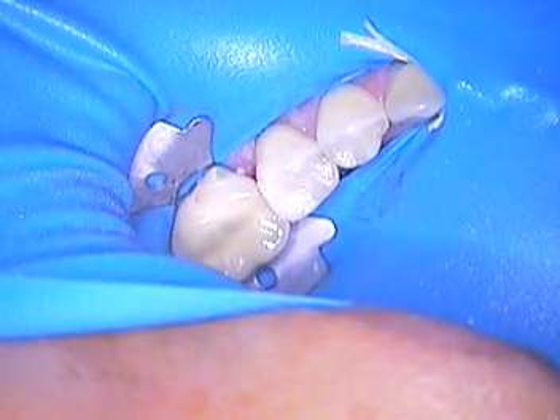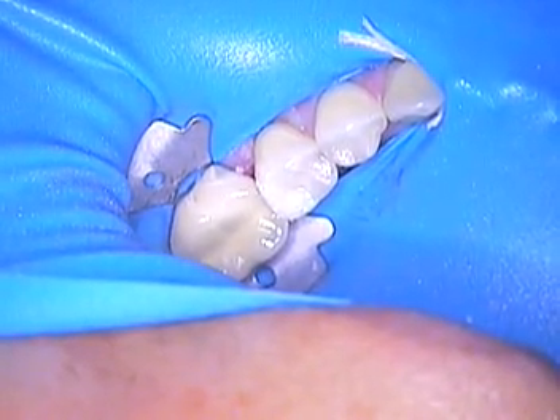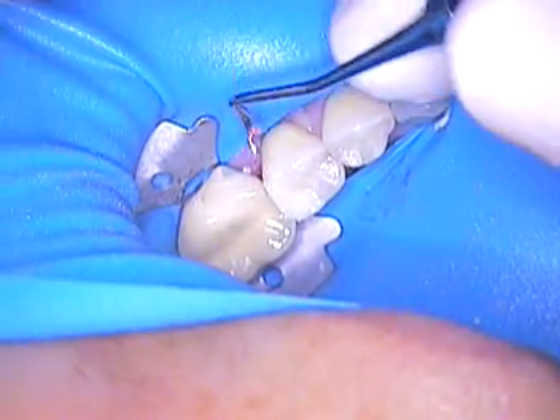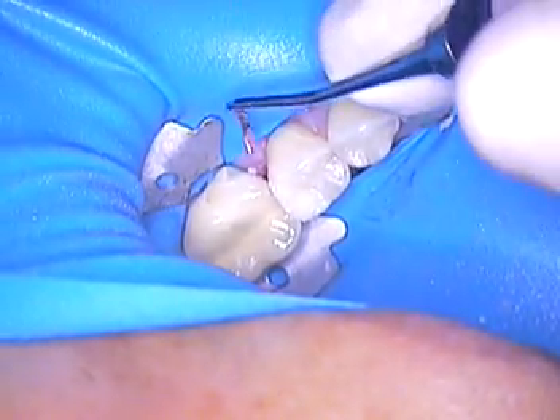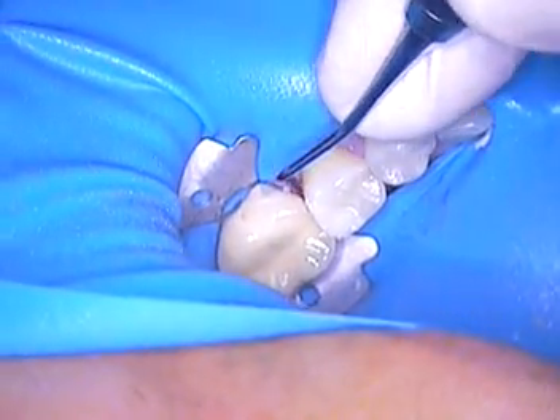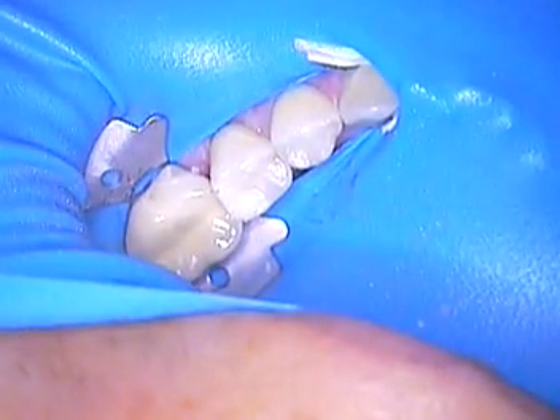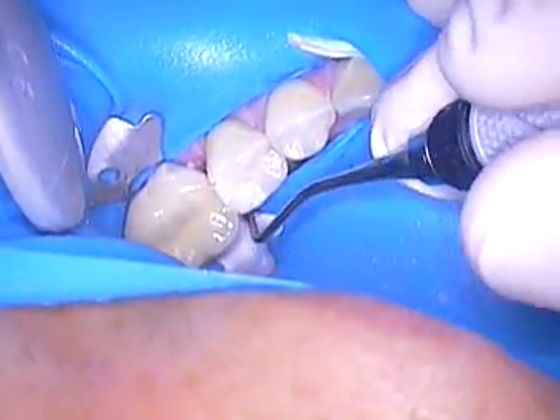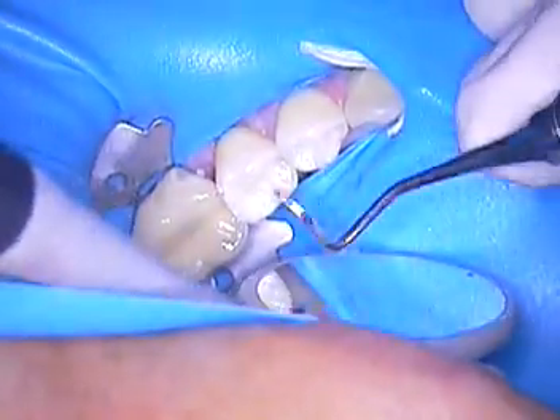We're back here live with our patient. This is Dr. Jerry Cuomo here with teeth numbers 20 and 21. We're finishing up. The next step is to use your scaler to get all that excess bonding agent away from the gum tissue. You don't want it there. The best way to do it is just take a scaler and go get it.